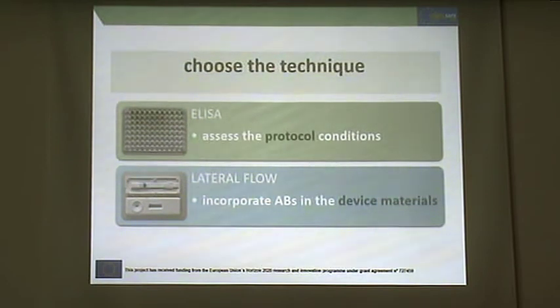When we deal with the lateral flow, the key issue of the development is how we can incorporate and distribute the antibodies on the device material, which are the pad and the membrane, and the cellulose membrane.